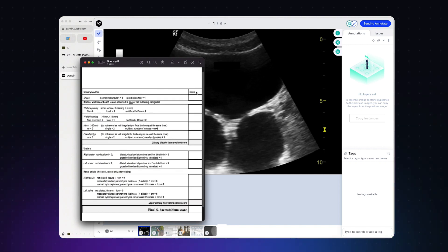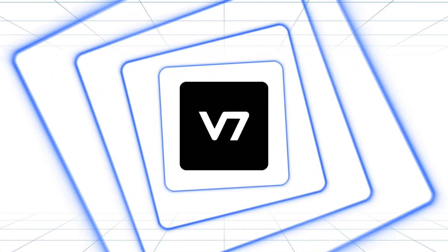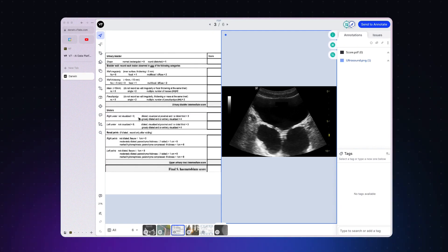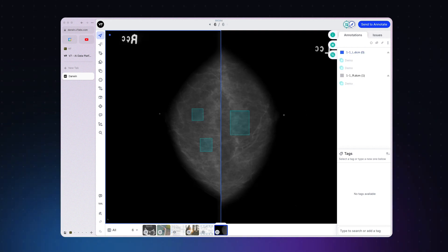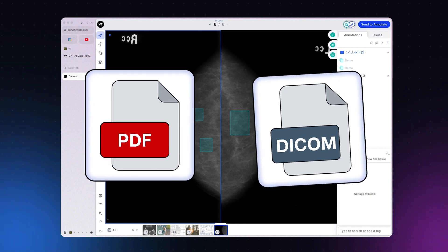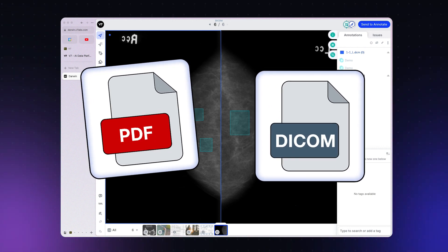For some annotation tasks, having only one file available on screen just isn't enough. Luckily, you can annotate multiple files on the same screen at once using slots. This is especially useful for medical use cases like mammography hanging protocols, but can be used for any scenario where multiple files and file types are required on screen at once.